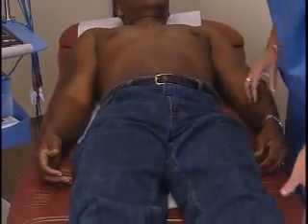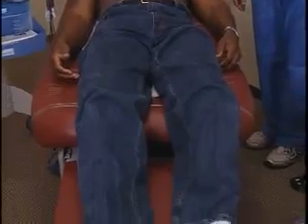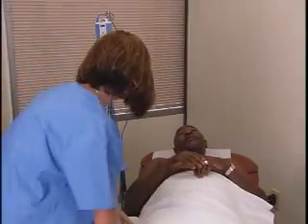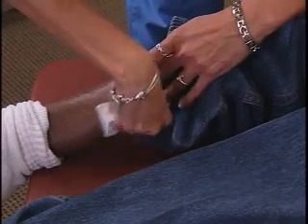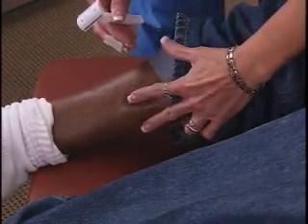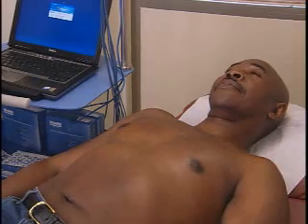The patient should be relaxed and in a comfortable supine position with the legs and arms supported. Keep the patient warm to avoid shivering and/or muscle tension. This could create noise that may interfere with the ECG tracings. Always shave the electrode area and then clean the area with alcohol. Before applying the electrodes, make sure that the cleaned area is completely dry.